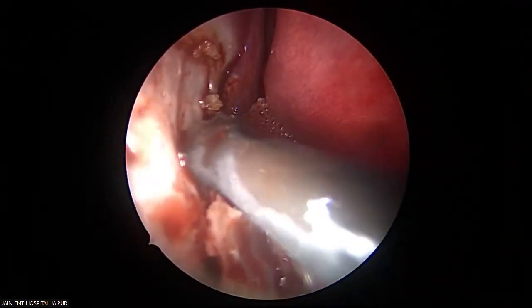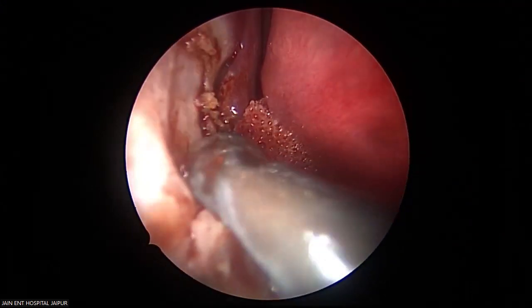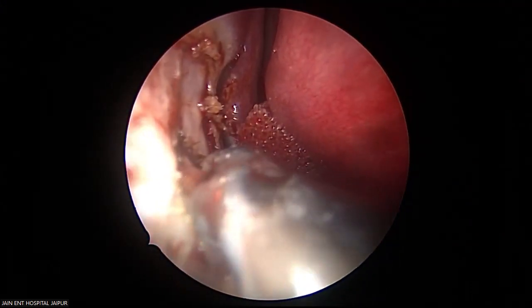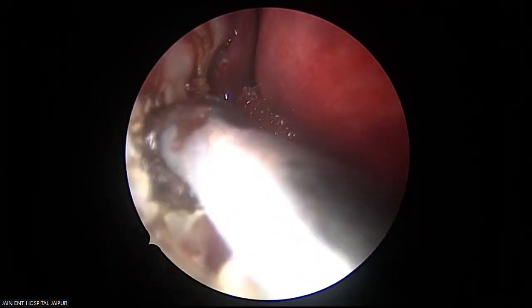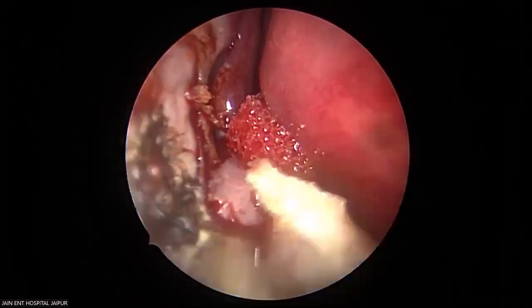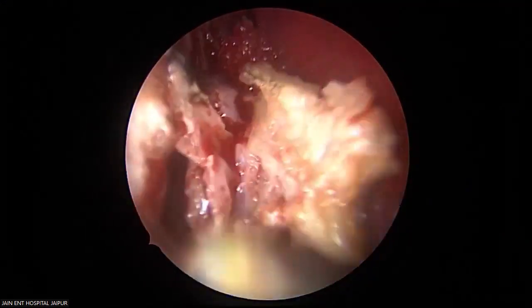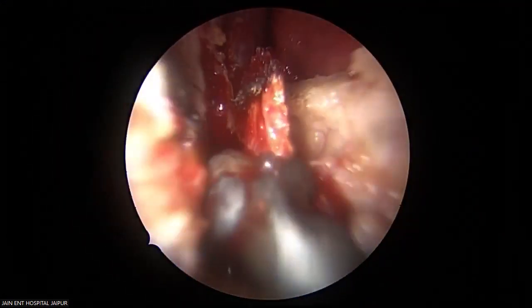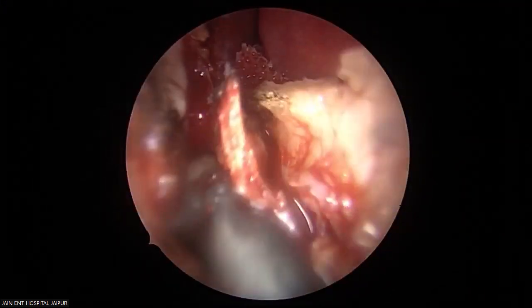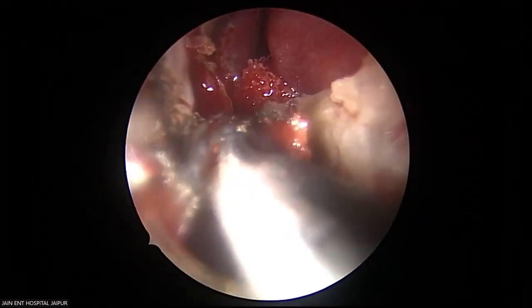See, like this, bleeding coming from the bone? I'm using my suction cautery, insulated suction cautery. On bone, never apply your coblator. Here again on the bone. See this?